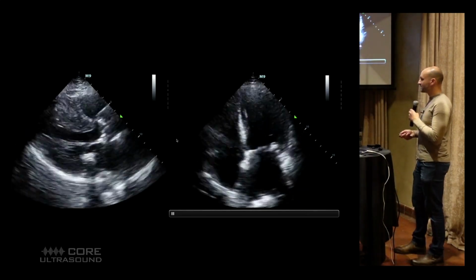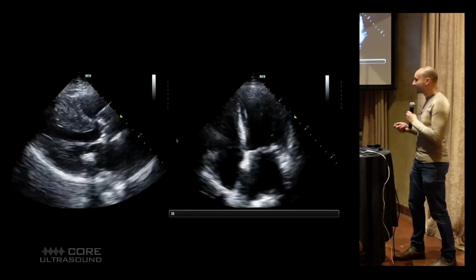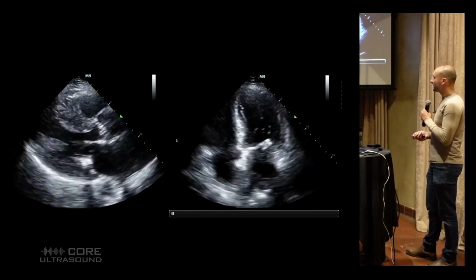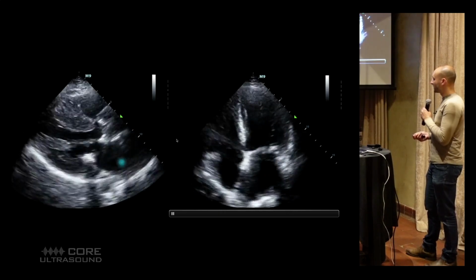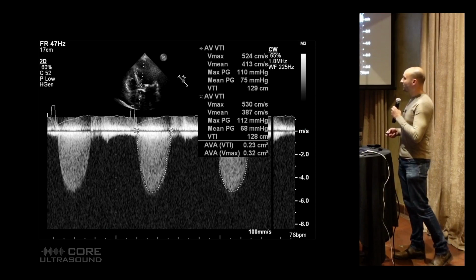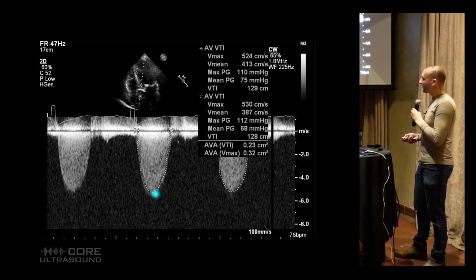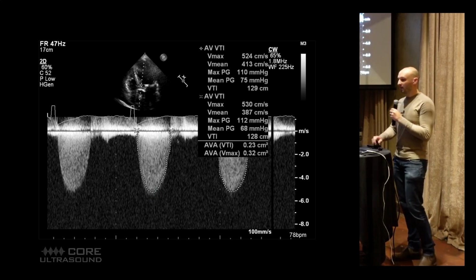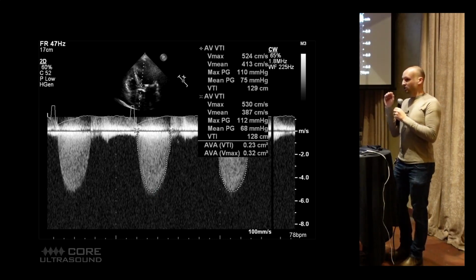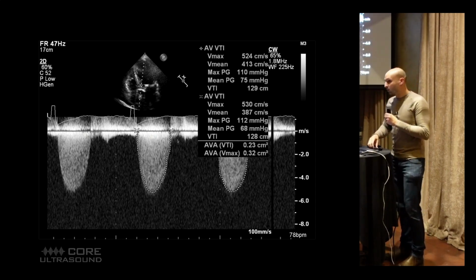So what you do for this, and this is the one calculation that I usually do with aortic stenosis specifically, because that's kind of the critical one, you get an apical 5-chamber view. Over here, it's not a great apical 5-chamber view, but apical 5-chamber view, and then you throw continuous wave Doppler through there, and all you're doing is you want to know what the peak velocity is through that valve. Now, you know when you pinch a hose, it shoots out super fast, right? You can actually detect that with aortic stenosis.